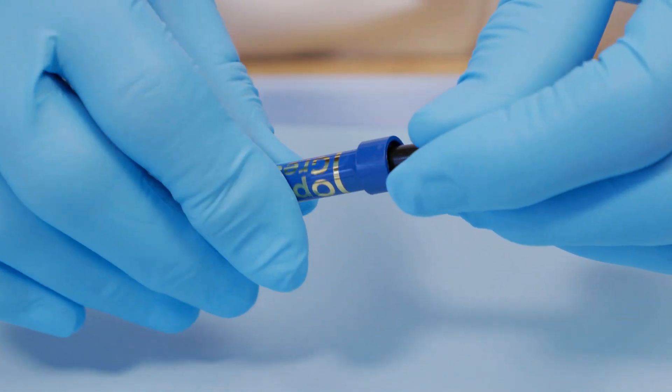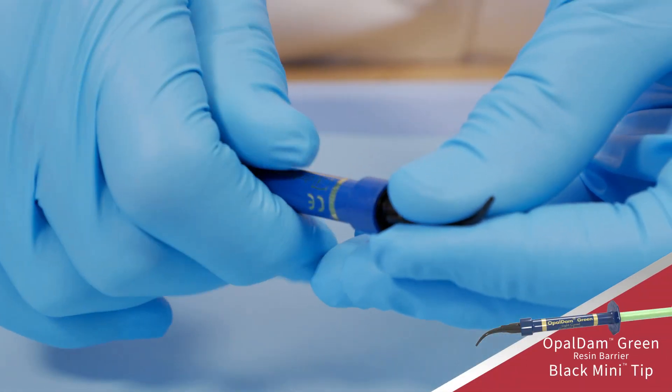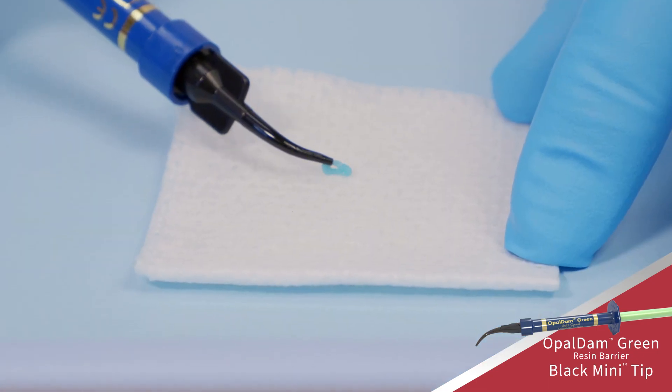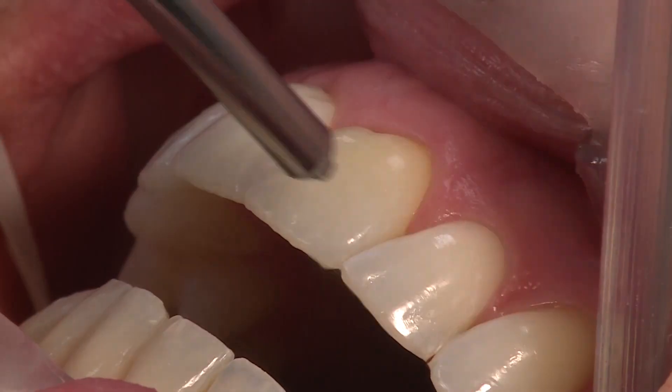Remove the LuerLock cap from the Opal Dam Green Resin Barrier Syringe and securely attach a black mini tip. Verify flow prior to placing intraorally. Rinse and air-dry the teeth and gums thoroughly.